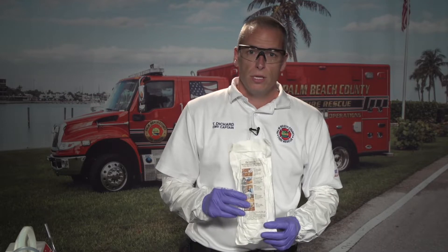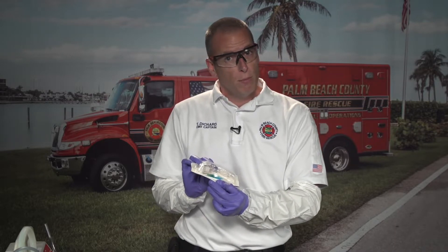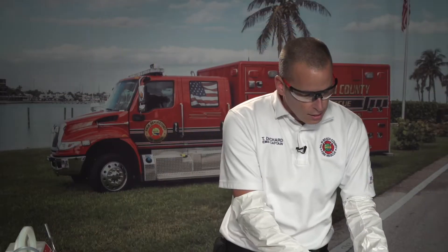At Palm Beach County Fire Rescue, we use the Quick Fix cricothyroidomy kit. This is for adults age 13 and greater, or with signs of puberty. For pediatric patients 12 years and under, we have the Quick Fix Junior. Inside the kit, you have your cut-down Shiley tube with a stylet — it's smaller than an ET tube but has a cuff. Also included are hemostats for opening the trachea, a scalpel, and a 10-milliliter syringe to inflate the cuff.